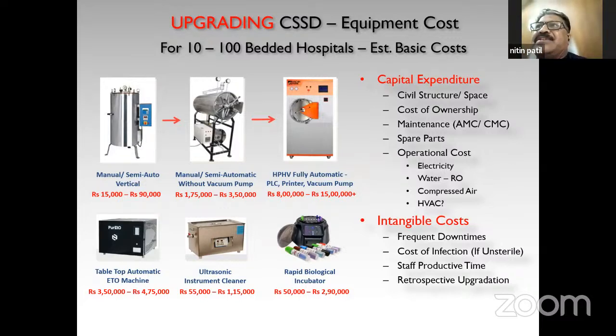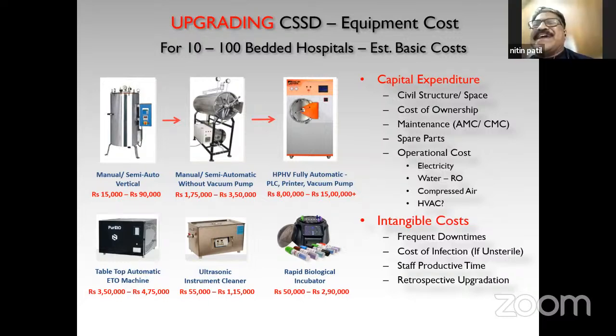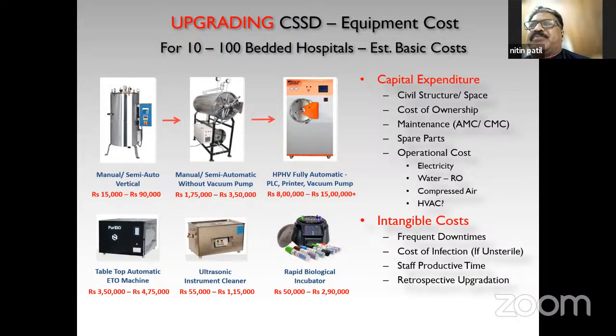Second thing, right, for 35 years now I am using an electric sterilizer, which is vertical. Some instruments, long instruments, don't fit into the drum. So because of the want of space, I keep them by the side of the drum, usually wrapped in cloth or linen, or sometimes like that only. And after the process is over and the proper pound pressure is achieved, we remove them by just checking sterility.